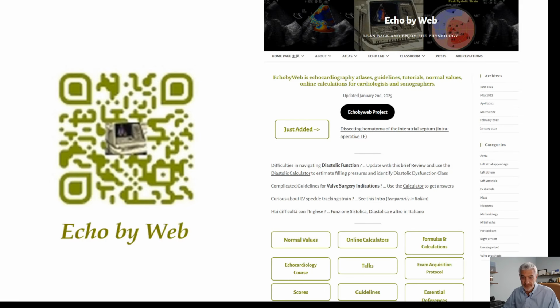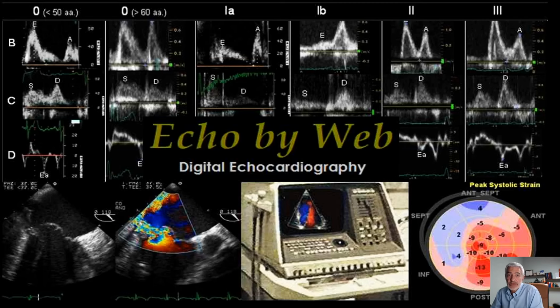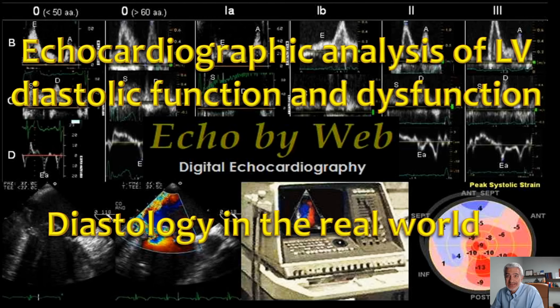The topic of this series of talks, which span over 6 videos, is the echocardiographic analysis of left ventricular diastolic function and dysfunction as seen in the real world. It is a fast, synthetic, basic approach to this topic, which is quite large, and I will provide further on a large video with a more in-depth approach.